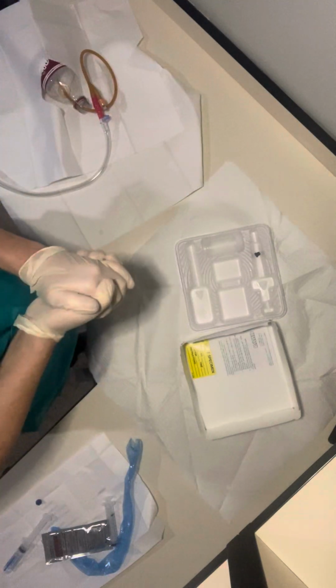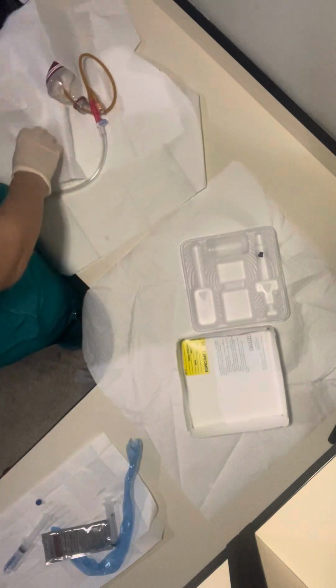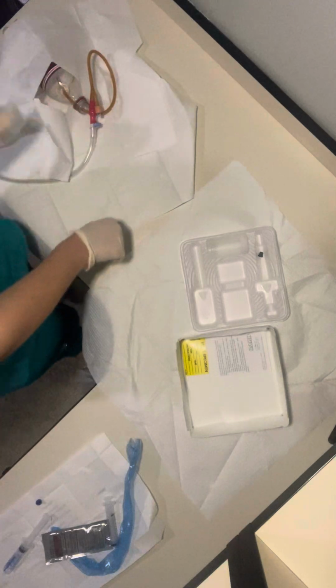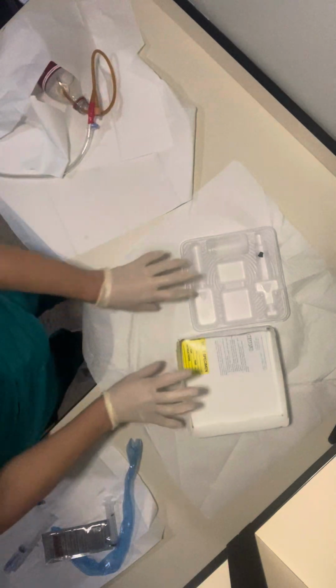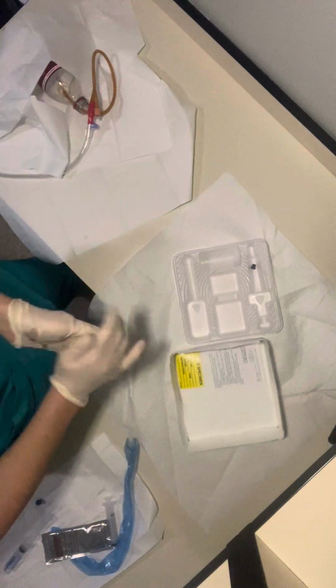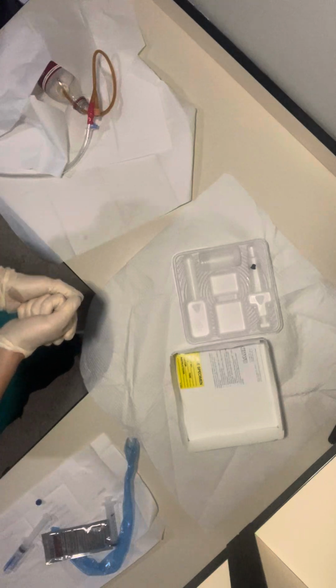I would remove everything, get everything out from around the patient, remove my gloves, perform hand hygiene, and if a urine specimen was needed, then after I performed hand hygiene, I would put clean gloves on and obtain the specimen.